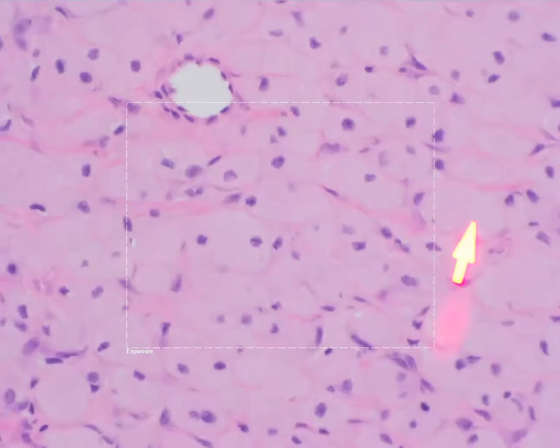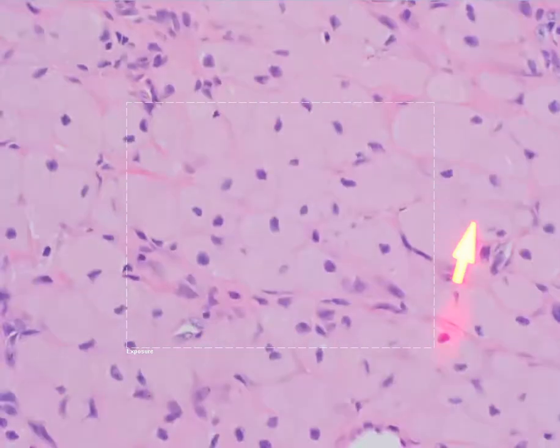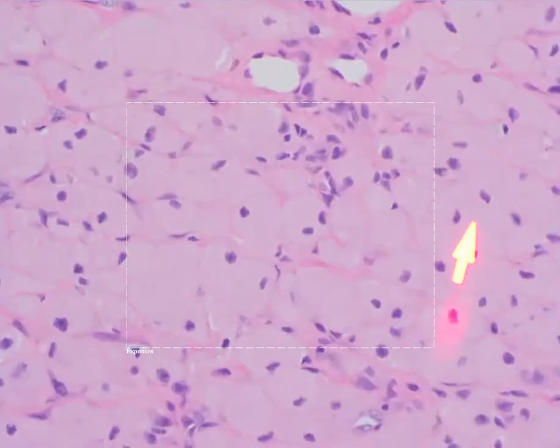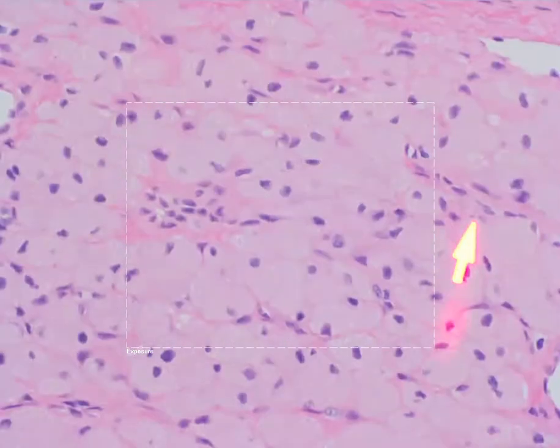Sometimes you'll see these small, what I like to refer to as condensations of the granules into these pink globs or intracytoplasmic spherules. And these are usually referred to as pustulo-ovoid bodies of Milian. And they're really just condensations of membrane-bound lysosomes. And I'm going to try to find a good example of that structure here.